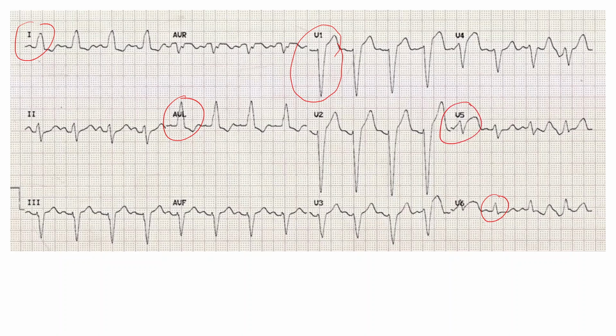Here in V5 it is not very prominent, but in V6 you can see there is a predominant R wave, and a dominant S wave in V1. What else? You can see there is absence of Q wave in lateral leads. There is no Q wave in V5, V6, no Q wave in lead 1 or aVL. So all the lateral leads have lost the Q wave. R wave peak time is not very essential to demonstrate here. This is a case of LBBB, left bundle branch block.